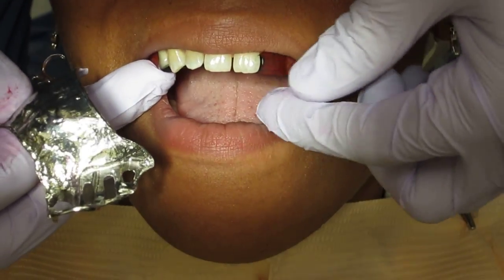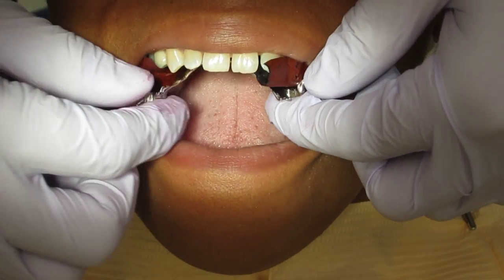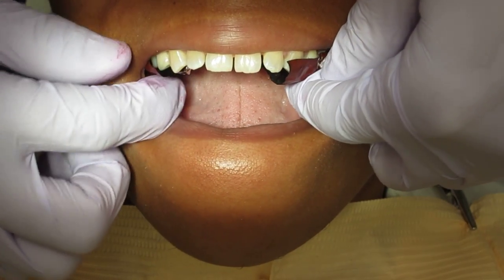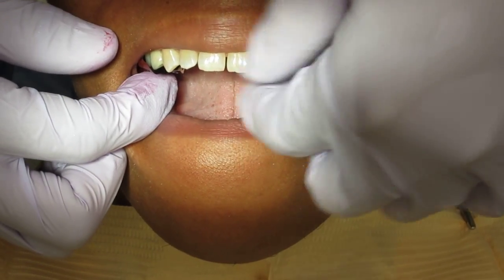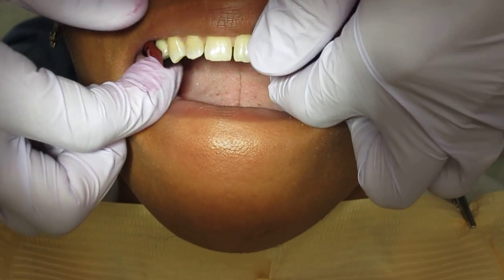So what we do is we take it, you can wet it, place it on the teeth, and then just slide your RDP intraorally. Try to find the right place. There we go. And then just seat it.